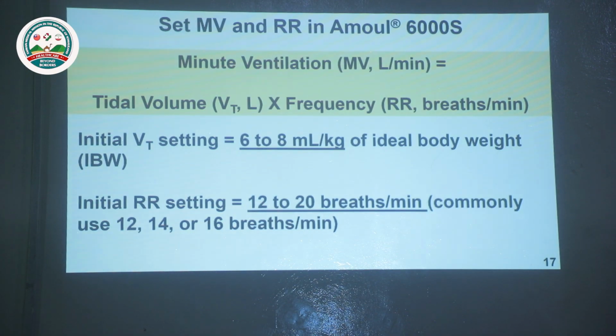And next is to set the respiratory rate. Usually we set the normal range of respiratory rate around 12 to 20 breaths per minute, and we commonly use 12, 14, or 16 breaths per minute.